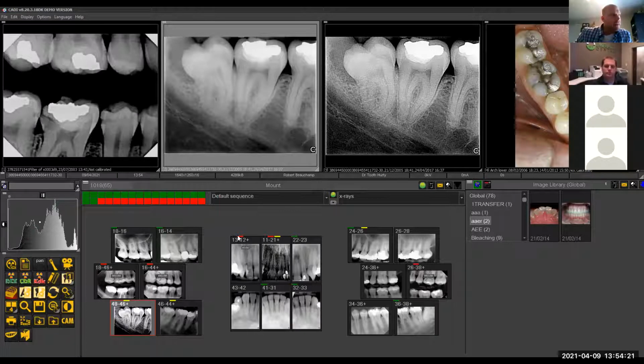It's just that we found that sometimes, based on the positioning of the X-ray head and the variety of X-ray heads within a practice, even though there are three of the same manufacturer's X-ray heads, they have differing X-ray exposures, believe it or not. Some of them are more precise, or the mA and the kVp, even though it's exactly the same, we've seen a wide variety of results.